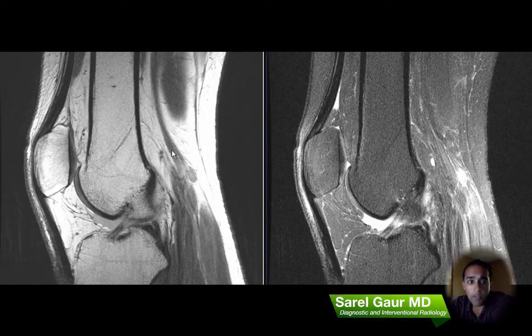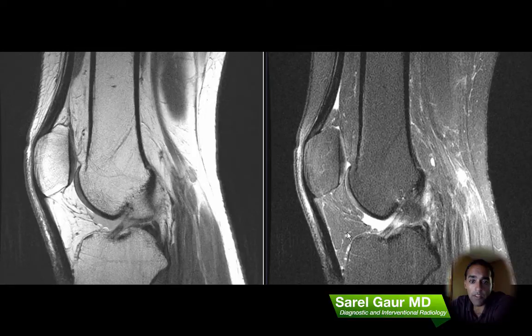Here I have the sagittal set of images. I've got a proton density set of images here on the left — these are proton density weighted — and I have a T2 weighted set of images here on the right with fat suppression.